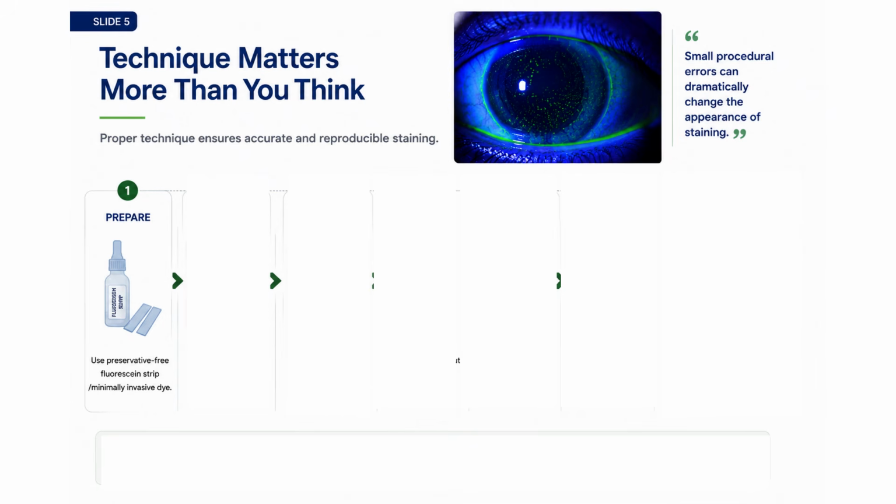Think of it like adding food color to a glass of water. If you add a few drops, it gives you a clear color. But if you put in the entire bottle, then everything becomes uniformly dark. The same happens with fluorescein.